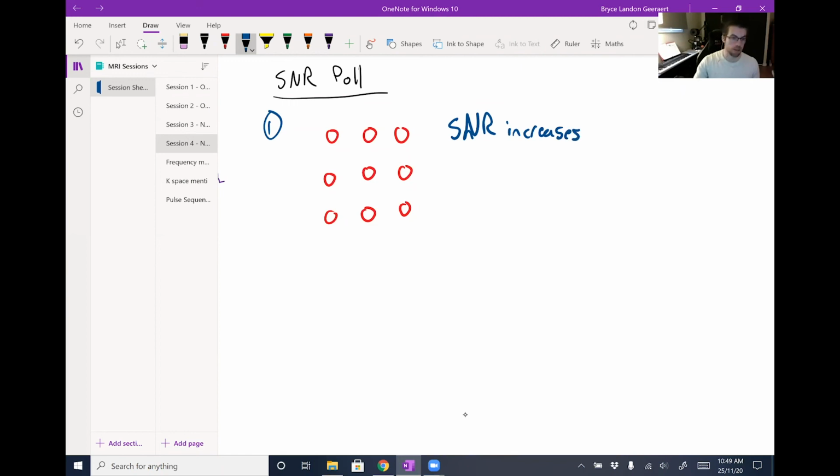And the reason for that is that noise is always the same, right? It affects each voxel with the same magnitude, the same amount of effect of noise on each voxel, regardless of their size. If there's a voxel that's 10 millimeters wide versus 1 millimeter wide, they both have an equally likely random chance of machine error that will cause that area to be slightly lighter or slightly darker than it's supposed to be.